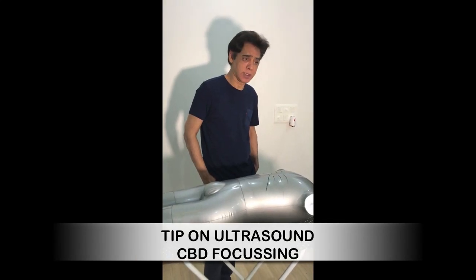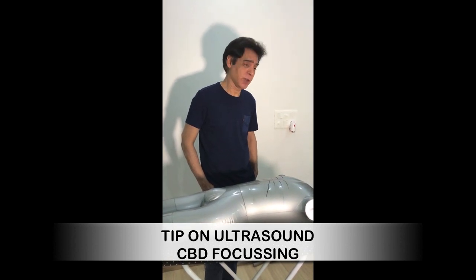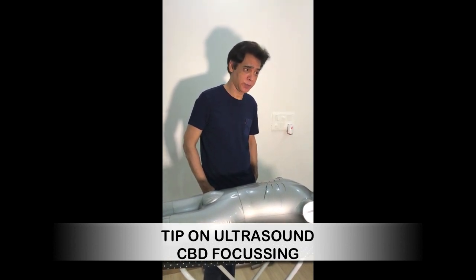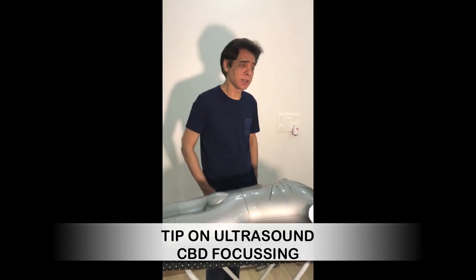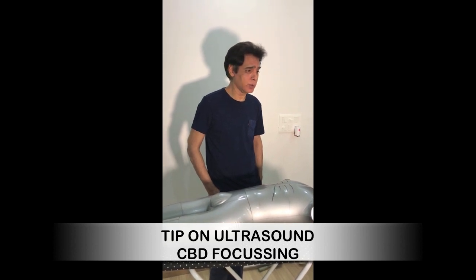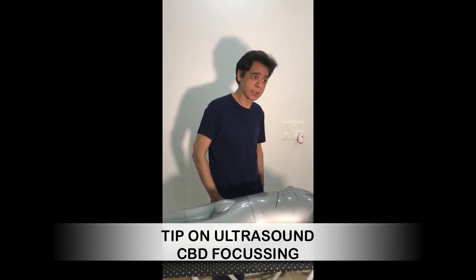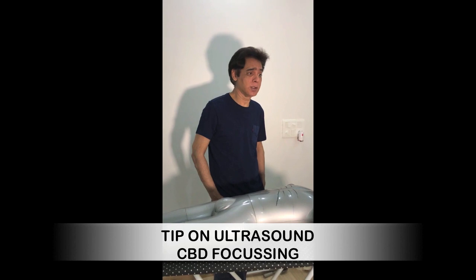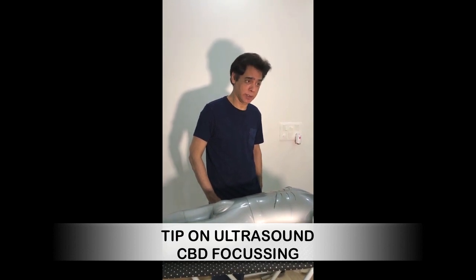So the present session is about focusing of the common bile duct. It's a very important area of concern. The proximal part of CBD, which is in the region of the porta hepatis, close to the neck of the gallbladder, is usually easy to focus. But the problem comes as we move towards the distal part, because the gas shadows from the second part of duodenum tend to overlap this area and sometimes it becomes difficult.